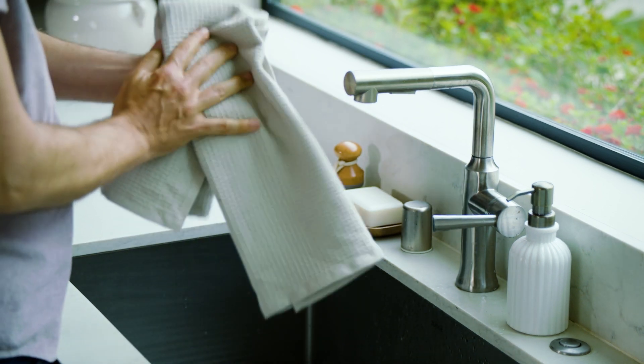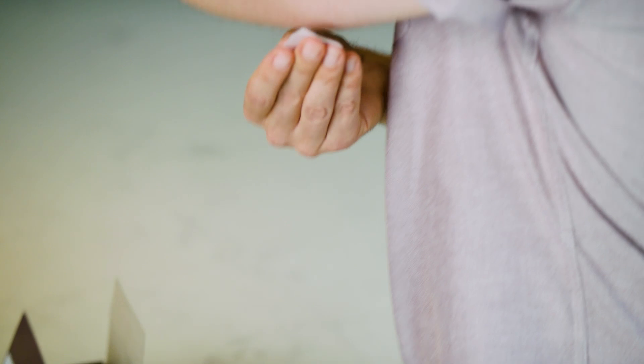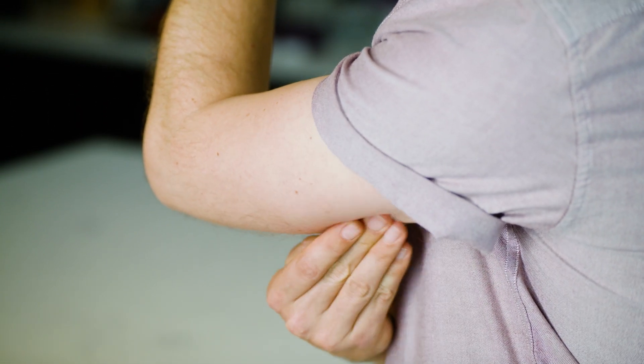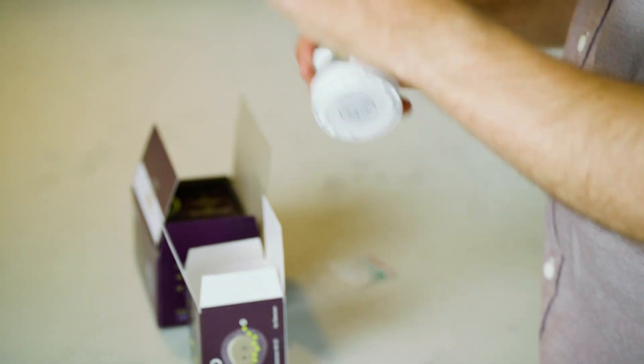First, wash and dry your hands. Next, choose a site on the back of the upper arm with enough fat to avoid muscle and that's not likely to be bumped, pushed, or slept on. Clean the site with an alcohol wipe and let it dry for at least 10 seconds.